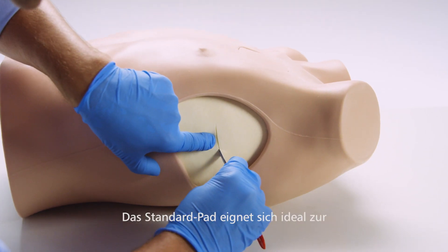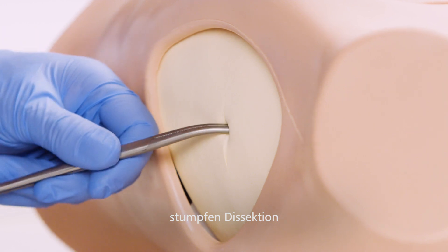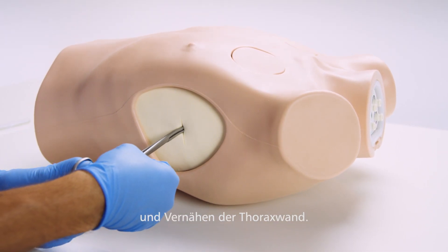The standard pad is ideal for practicing blunt dissection chest tube insertion and suture of the tube to the chest wall.